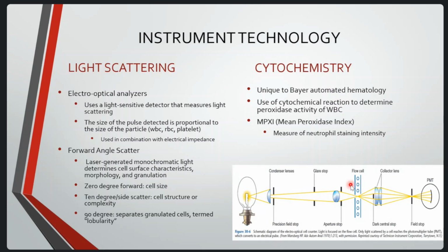So this is what I'm saying earlier. Yung cells, for example, nasakshas sa machine, they will go through a narrow tube. And once they enter the tube, since may resistance yan, the higher the resistance, the greater also is the size of our cells. So madidetect mo na yung size. Another one to help us determine the size would be the light scattering.